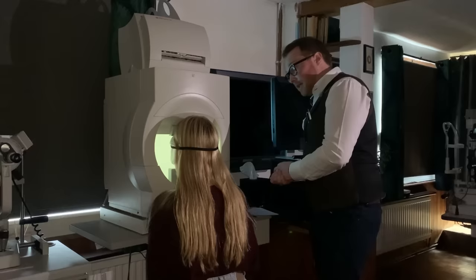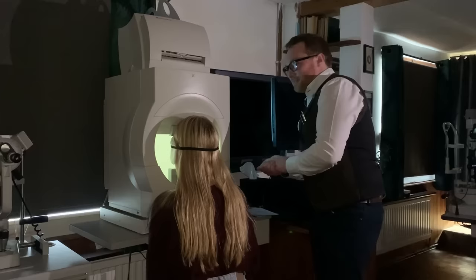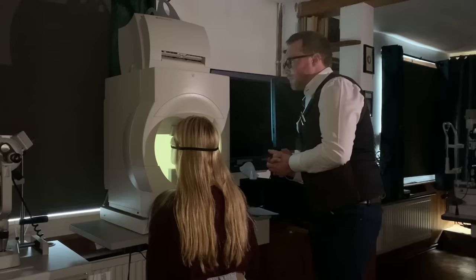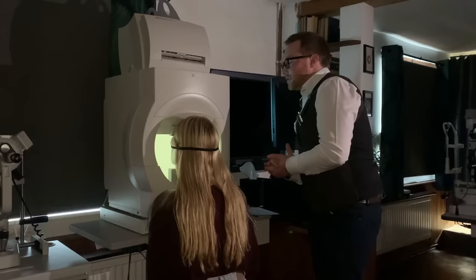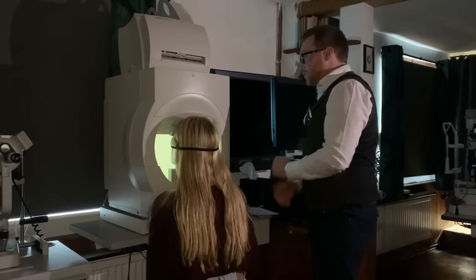The machine will double check things. So if you accidentally press it when you didn't mean to, or if you forget to press it, it will go back and double check things. And it's absolutely fine to blink as normal. Don't feel you've got to stare through the whole thing. It's about 2 minutes, so it does take a little while. Just blink as often as you need to. A little beep when it's happy and ready to go. Good. Give it a second. And off we go. Just pressing the button whenever you see a little white flash.